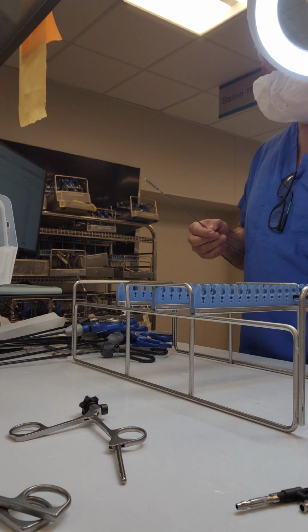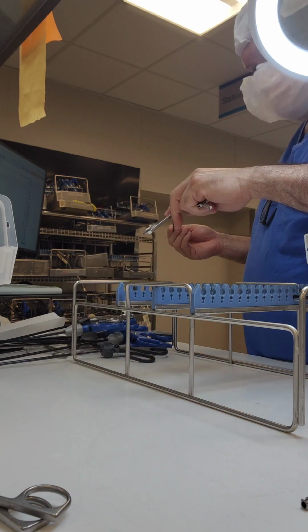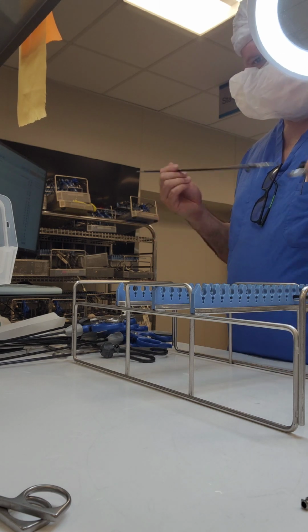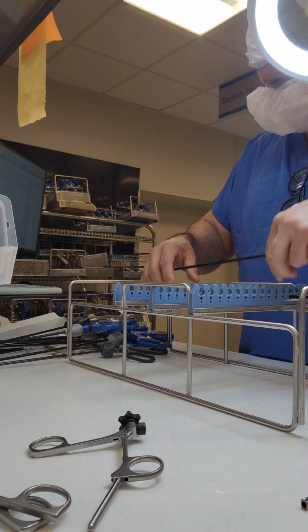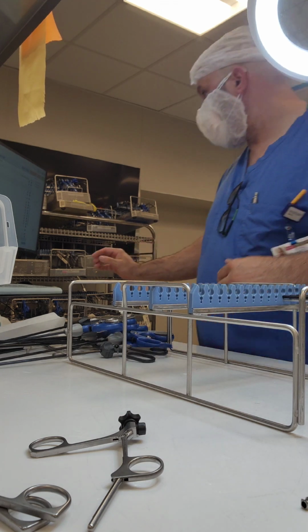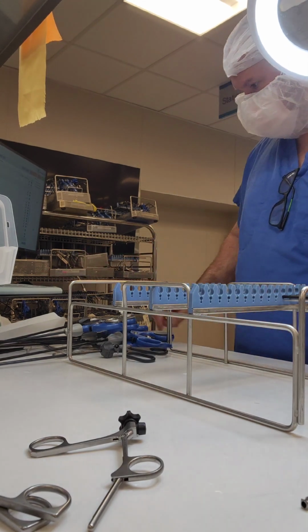Checking those inserts. You have to check those inserts for cleanliness. And here's the function test yet again. It opens and closes, and then take it apart, because we do not keep our laparoscopic instruments assembled for sterilization. We disassemble them. I continue this process, checking off the boxes, making sure everything is where it's supposed to be.